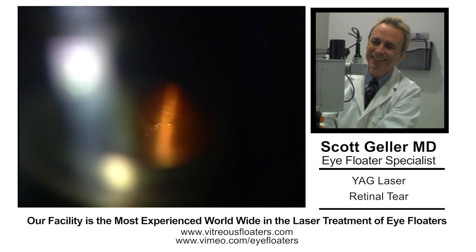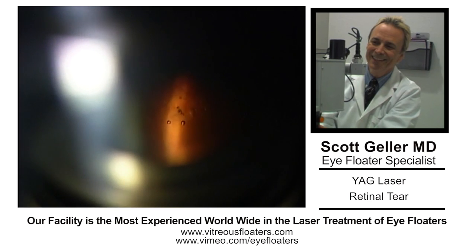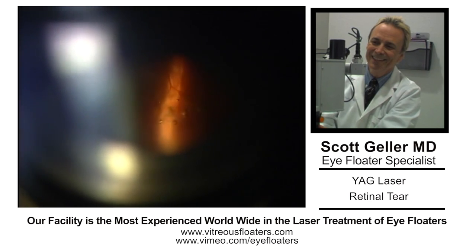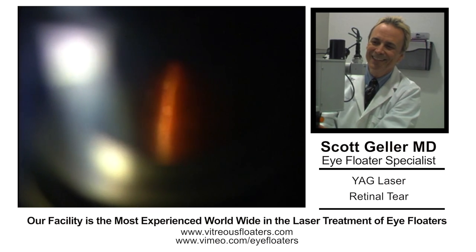If you get off axis from perfectly perpendicular, you will get the optical aberration of coma. You won't get the optical breakdown and you will not achieve what you're trying to do — and you can create a retinal burn.